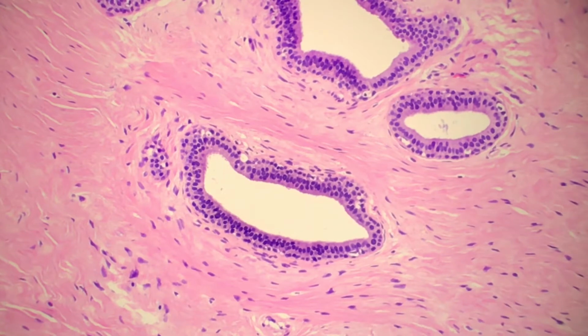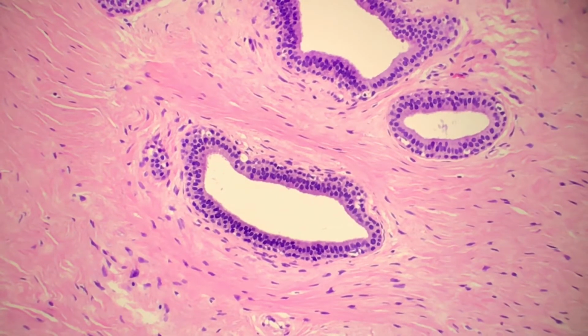Some other things, and I will show you this in some of the later slides, is that you can often have this myxoid change. So what that means is that your stroma is going to appear a little looser, a little more gray-bluish, and that often is seen in younger patients or newer lesions, whereas the hyalinized stroma, and hyalinized just means like a dense collagen deposition, and that's also when you would think about calcifications. These you tend to see in older lesions or older patients. So those are things to think about. I'm going to show you, this has more of a myxoid type background. We're not seeing that right now. Right now we're just seeing standard fibroadenoma, but I do have some of that to show you.